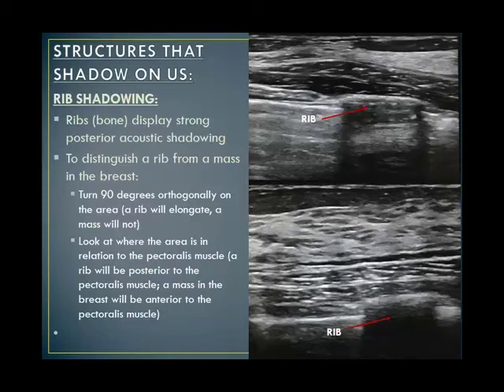At this point in your career, do you ever get confused by these things, or you get it down? Yeah. I would say within a year of picking up the transducer, you understand these things. But it takes time. Yeah, and looking at pictures to say, oh, okay, I vaguely remember that. She's talked about that. So hopefully I'll be in your guys' heads. No ribs. So look for your pectoralis muscle.